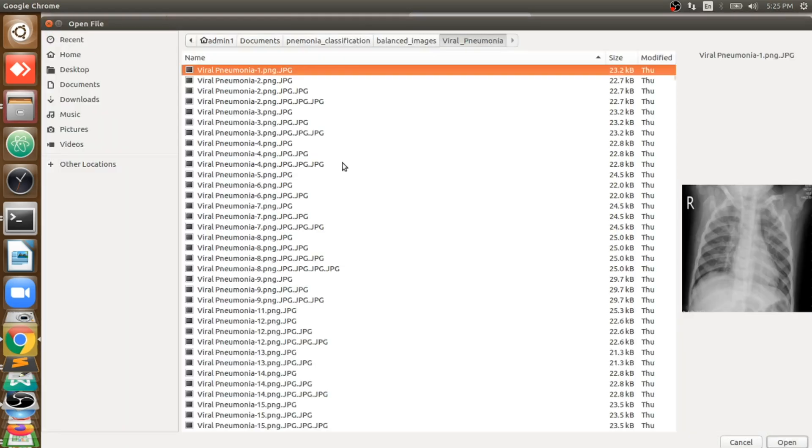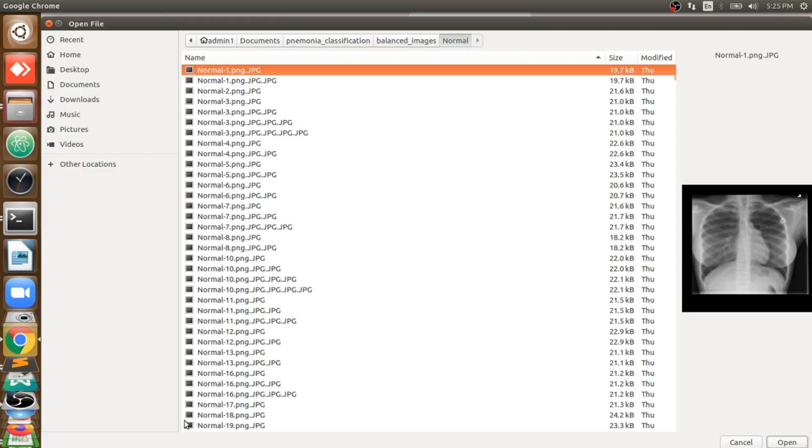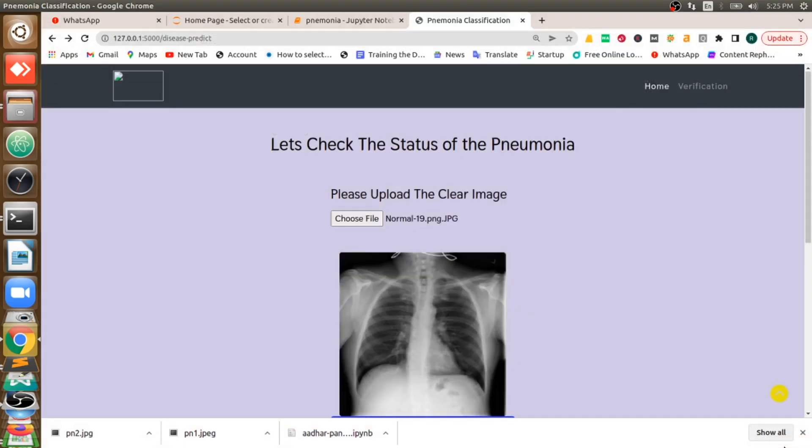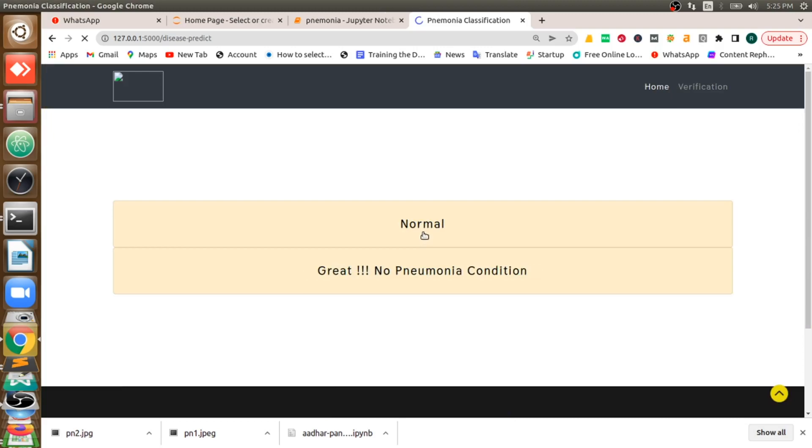Even you can give some normal images which are not affected. I'll give a normal image as input that you can see here. If I ask for the prediction, that will give us normal. Great, no pneumonia condition, so he is very healthy.